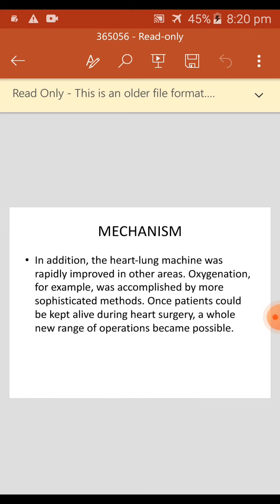Tubing systems for extracorporeal circulation. The tubing system is used to connect the individual components of the extracorporeal system and forms a closed circuit with the vascular system of the patient. Depending on the location, either PVC or silicone tubing is used. Tubes are available in different diameters and wall thicknesses.